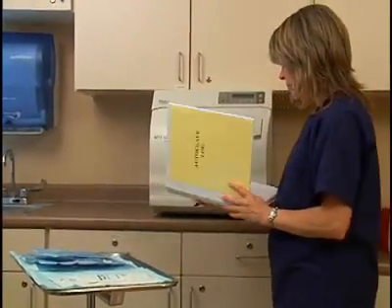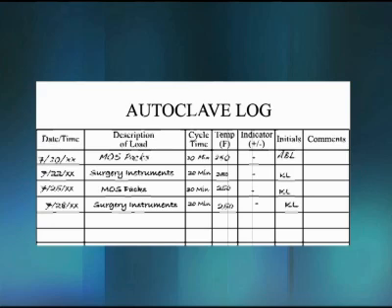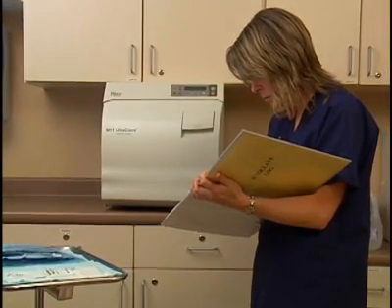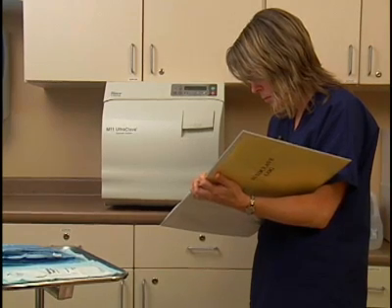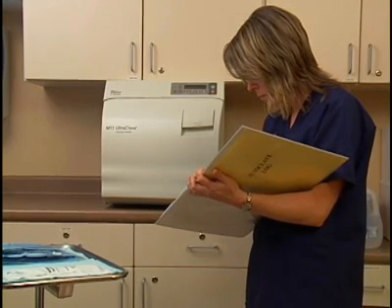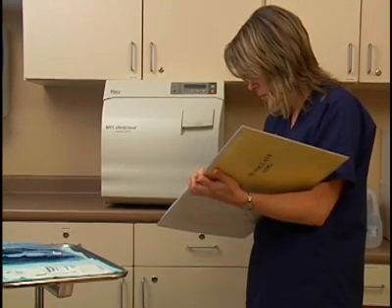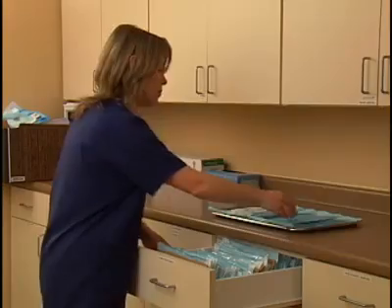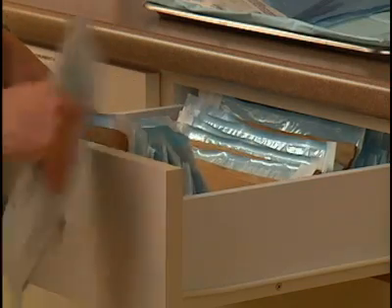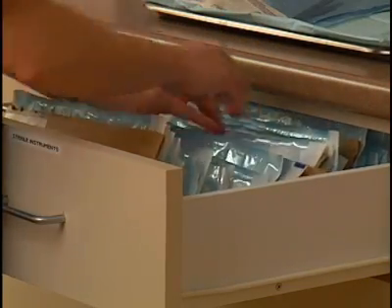Record monitoring information in the autoclave log. Include the date and time of the cycle, a description of the load, the exposure time and temperature, and your initials. If a biologic indicator was included in the load, process the indicator according to the medical office policy. In this office, the biologic indicator, along with the control, is sent to an outside lab for processing. When the results are returned to the office, record them in the autoclave log. Store the packs in a clean, dust-proof area with the most recently sterilized packs placed behind previously sterilized packs.